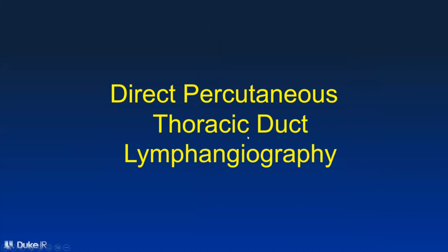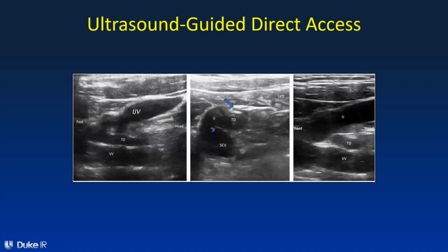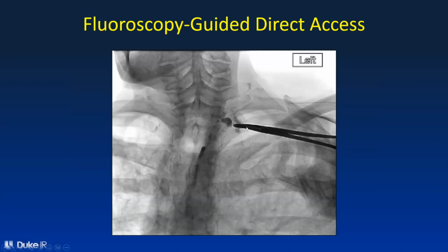So another technique is direct percutaneous thoracic duct lymphangiography. And again, these are techniques just to inject dye into the lymphatic system. This one can be performed using ultrasound or using fluoroscopic guidance. So using ultrasound, you try to find the thoracic duct, which is labeled here, and then you access it using ultrasound, and again, catheterize the thoracic duct backwards. Here, we're doing it under fluoroscopic guidance instead.